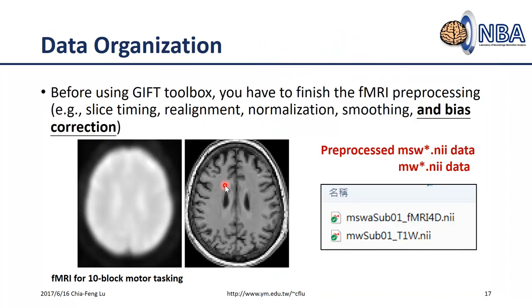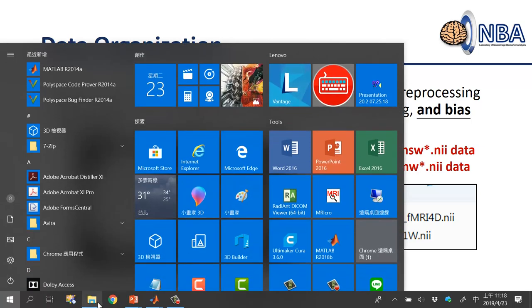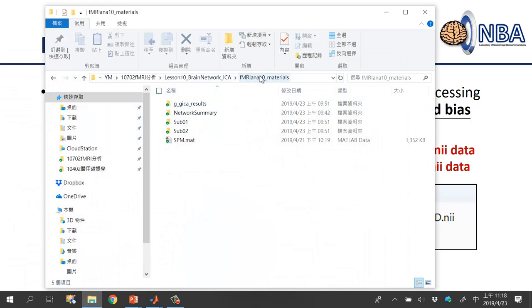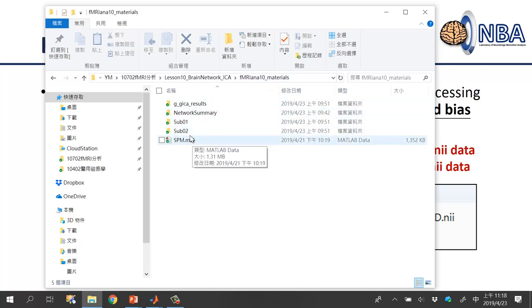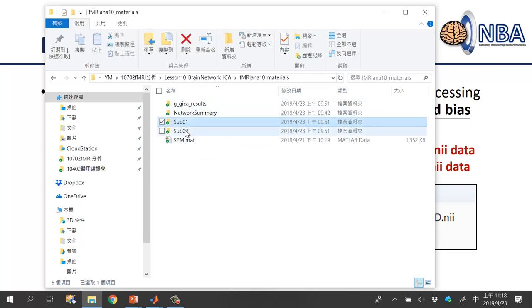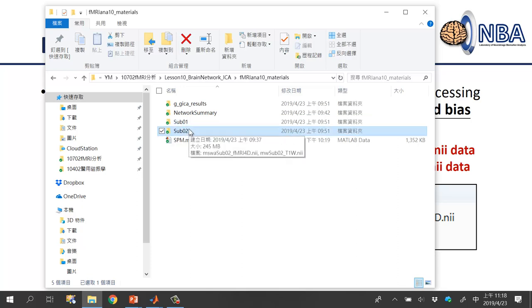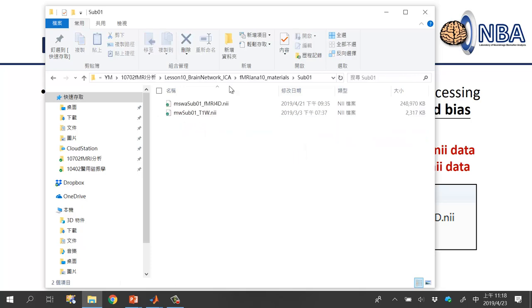Now confirm you have the correct dataset. After unzipping the provided file — fMRI Analysis Week 10 Online Materials — you should see four different folders and one SPM.mat file. Two of the four folders, sub01 and sub02, are the fMRI and T1 datasets provided.